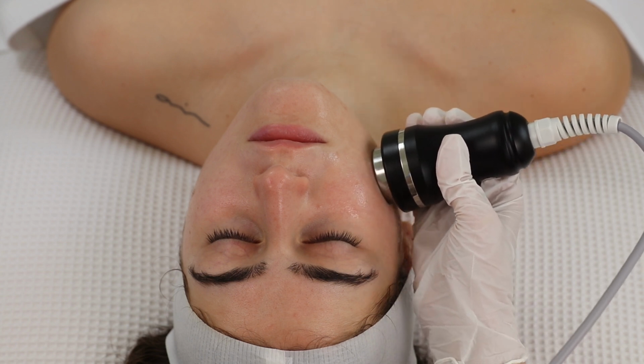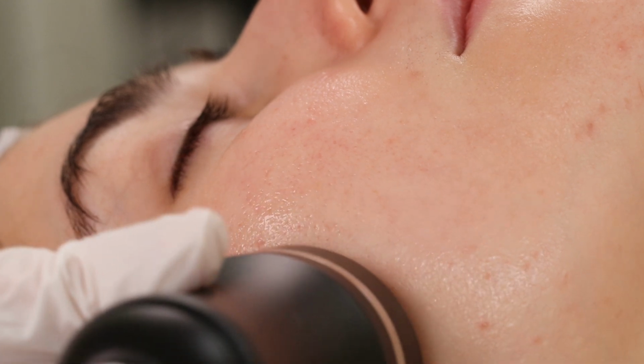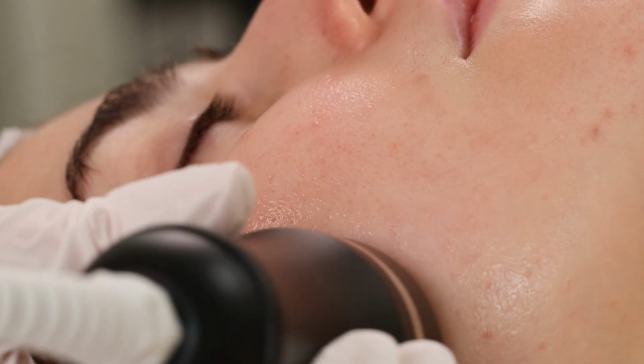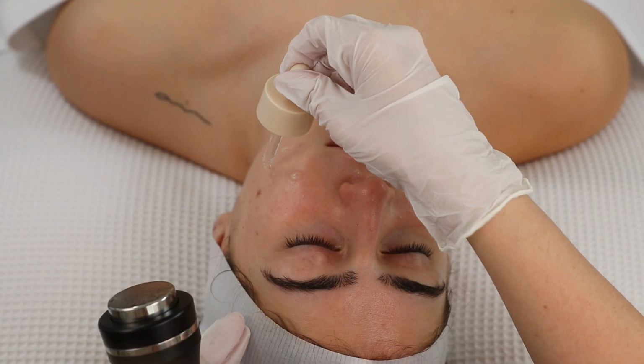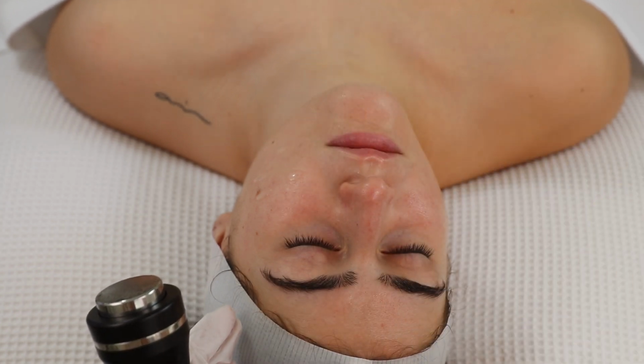And we actually used the ultrasound probe after the dermal roller, as there are already microchannels into the skin, and the ultrasound will only optimize the penetration of all the active ingredients that we're using, like the chemical peels and also the serums. When the right side of the face is done, you can move on to the left side, and we're repeating the exact same process.